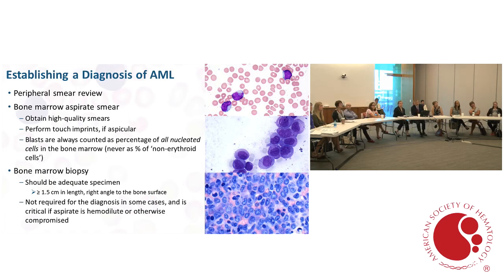So this is an example of patients that were referred to our hospital for presumed AML. Flow hadn't been done yet for cells circulating in the blood that were called others or even called blasts. And only one of them is actually from an acute leukemia case. Do you want to guess which cell you think is the real acute leukemia and which ones are not? I think the B. This one here? No, down. This one. Okay. Anybody else have a guess? This one here, big nucleolus, okay.